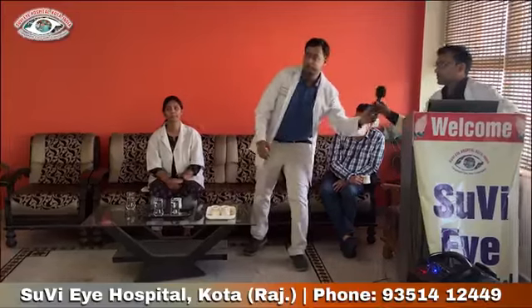Also the laser machine: practically what I have seen, the older the laser machine, the more power we have to use, because of the transmission through the fiber optic cable, which also wears and tears with the years. Newer laser machines have less damage to the fiber optic cable, so we have to use lesser power. Thank you.